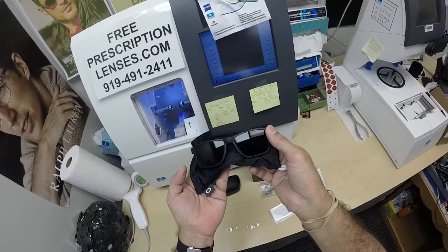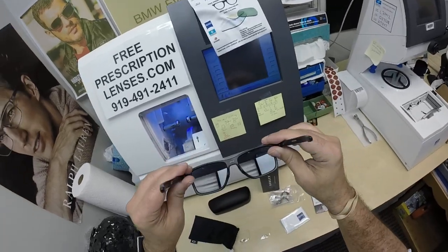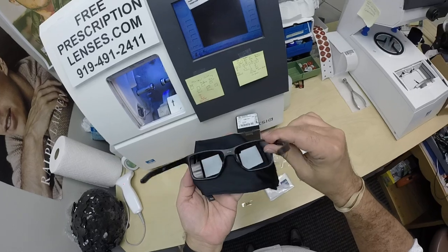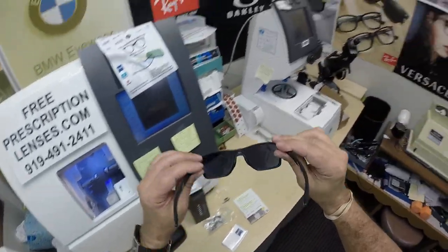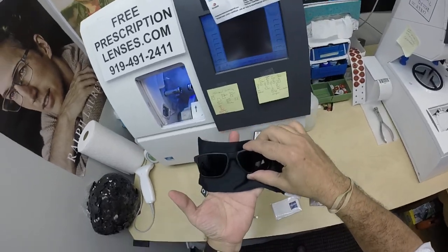Now people can see that silvery mirror that matches the silver logo on the side. When I turn it over, you can see the greenish hue of the DuraVision Sun back surface anti-glare. When he looks out, he sees the dark gray — when people look at him, they see that silvery mirror.